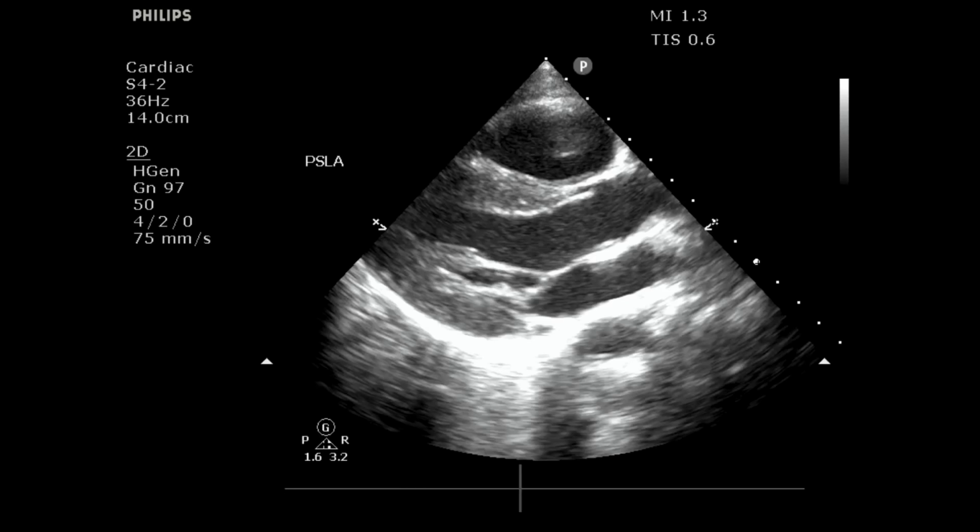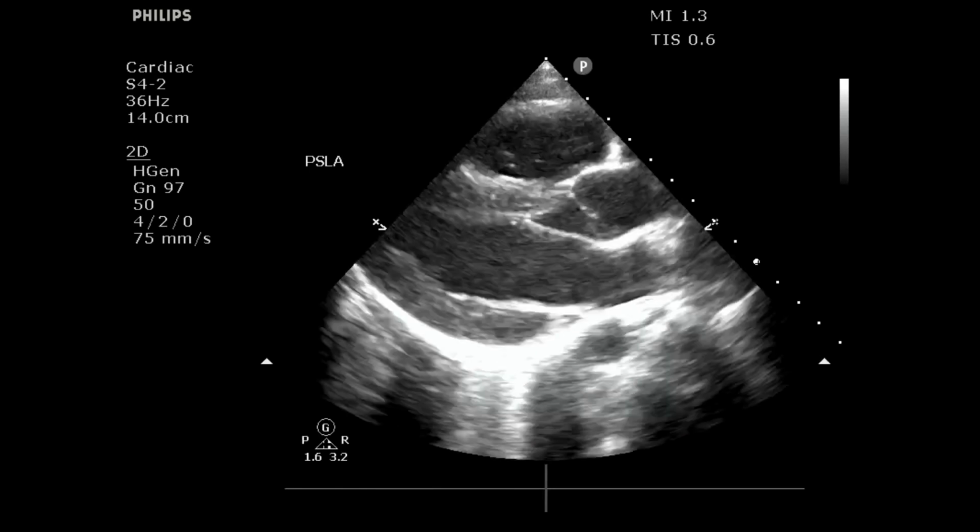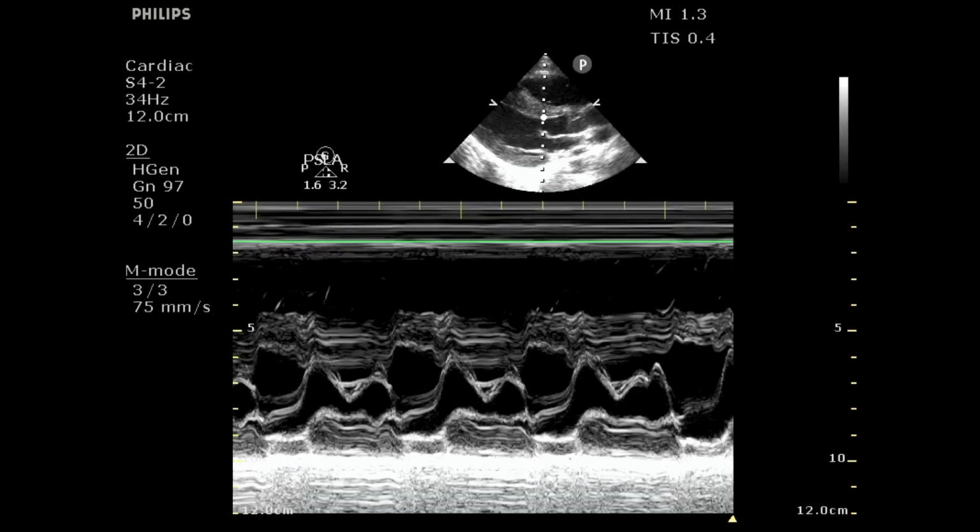In this patient, what we can see is that space is wide open, right? The aortic valve is wide open, the mitral valve is definitely closed shut, and there's nothing that's obstructing that outflow tract. And so this patient doesn't have that SAM phenomenon, the systolic anterior motion phenomenon that would be characteristic of hypertrophic obstructive cardiomyopathy. So we can check that one off the differential. So now we need to work ourselves down the differential list a little bit further, right? So let's move on to this one.